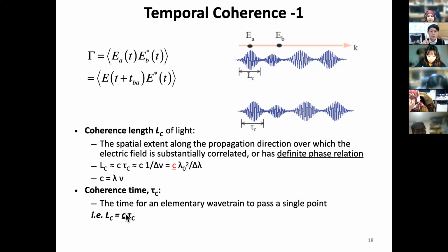Remember, when I call it coherence length, I'm not talking about spatial coherence. Coherence length is about temporal coherence, not spatial coherence.